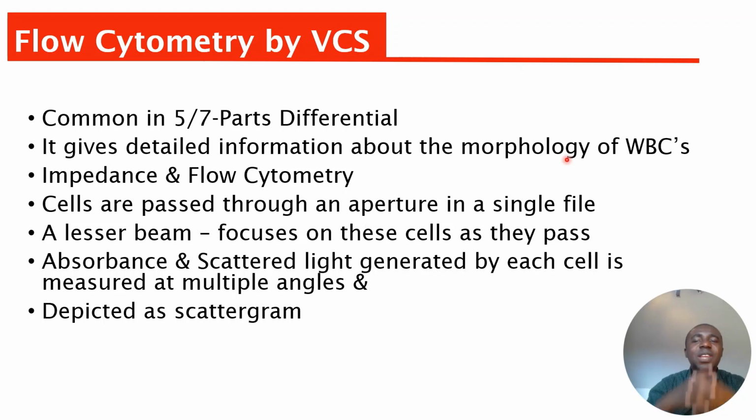So it doesn't just give you the count of the white cells, it can actually tell you more information about them. It might tell you this is an atypical cell, it can query atypical cells, it can query blast cells. So it will give you additional information. If there are immature granulocytes, you will also see them there, and it will flag it up. So this is why this technique is one of the reliable techniques.